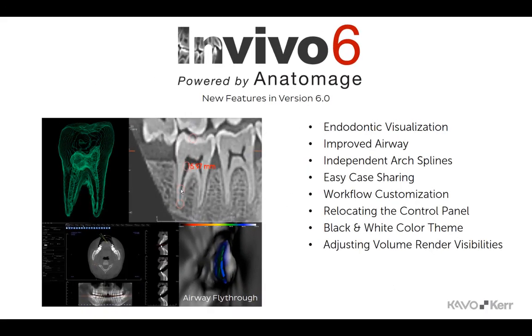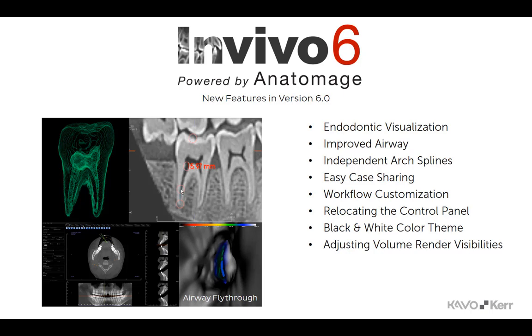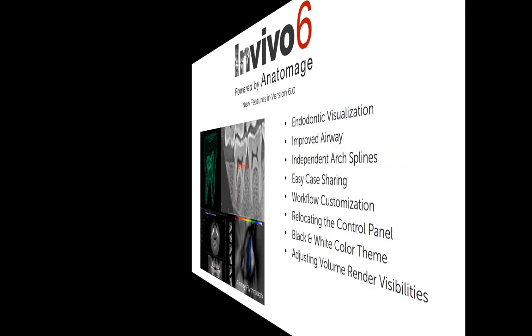Welcome to a presentation of the latest enhancements and additions to Invivo. With Invivo 6, doctors can create 3D volume renderings on their own computer, get cross sections, trace nerves, place implants, print and save images, analyze airways, and many more functions. Let's take a look at a few of the new features in Invivo 6.